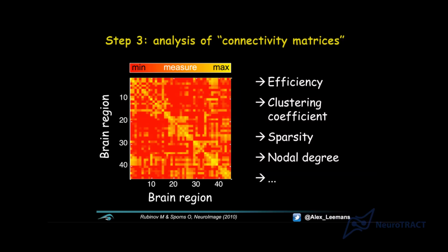And maybe these could be useful to identify brain regions that have been compromised in pathology. So maybe it's not just one region being affected that is the problem. Maybe it's a combination of specific regions which were interconnected that is important to know, right? So it opens up a new way of thinking about how brain damage is represented from a network point of view. So that's also very interesting.